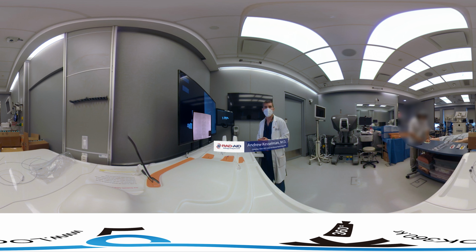So you introduce that until it's picked up by the machine. There you can see it sees the wire. We're going to get the microcatheter there shortly. Now you see it sees both. So now we're going to come out and we're going to try to go ahead and select the uterine artery. And let's see where this is going. It looks like it's going out laterally. A little injection. And that's in the uterine artery branch.